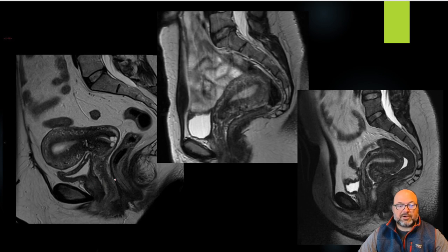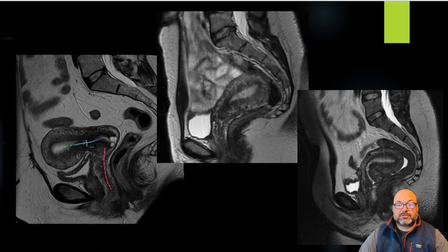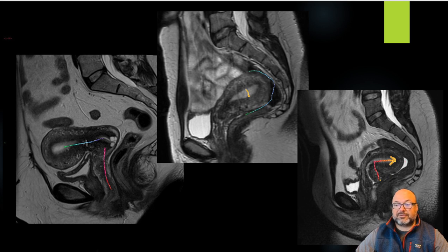Some MRI images just show how really significantly angulated the uterus can be, and again this is without any traction. So placing that tenaculum on the anterior lip here for an anteverted uterus — here is a retroverted uterus with the endometrial stripe and fundus up here — and then here is a retroverted, but also significantly retroflexed uterus. Look at how deeply that's really buried into the posterior cul-de-sac.